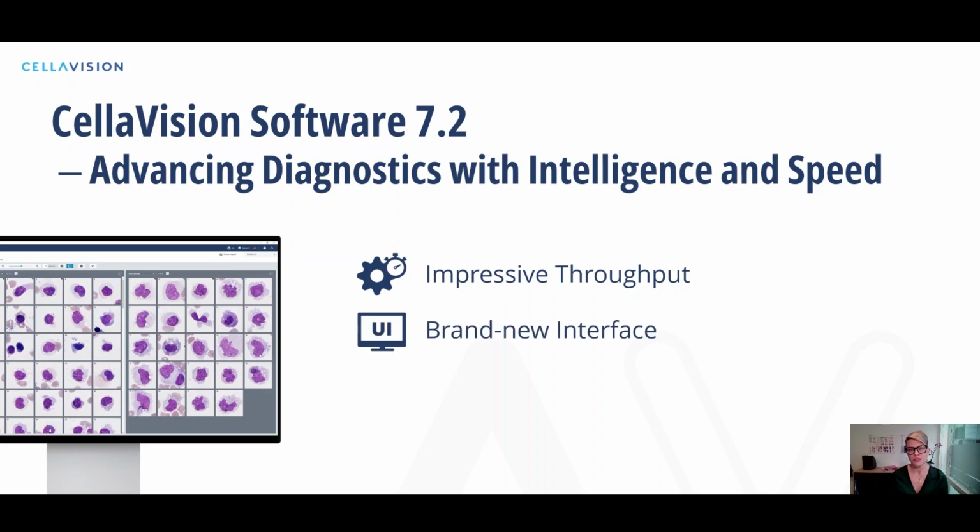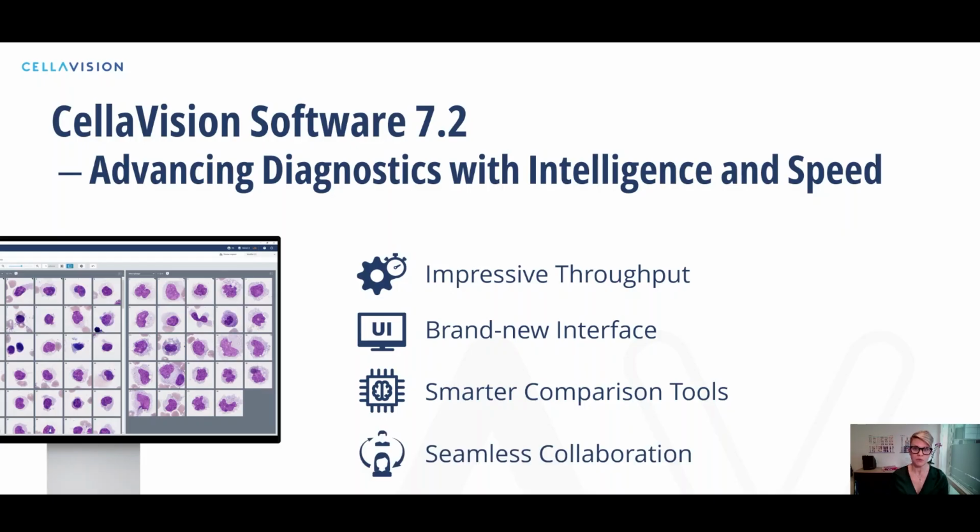We're also introducing a brand new interface that is more modern, more intuitive, and designed to make your workflow smoother and more efficient. Next, I will show you some smart comparison tools that make it easier to review and support seamless collaboration and differentials. And finally, there are some new features that support even more collaboration, helping teams work better together. So with that said, let's jump over to the software and take a closer look at some of the features.